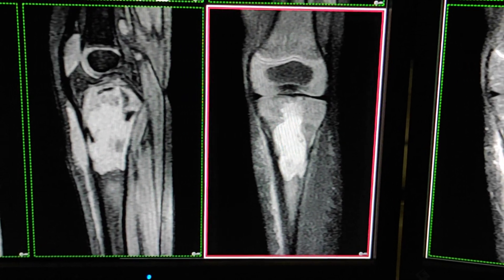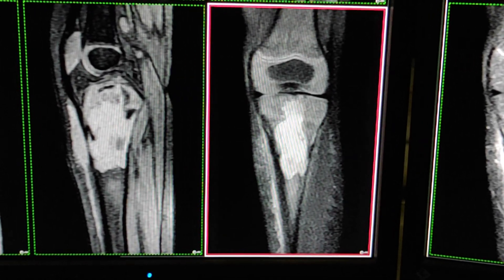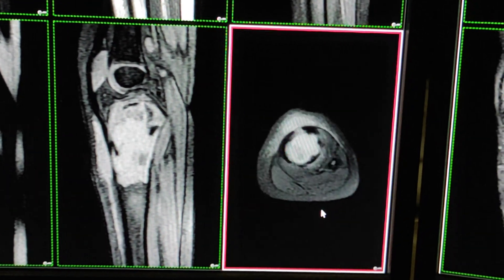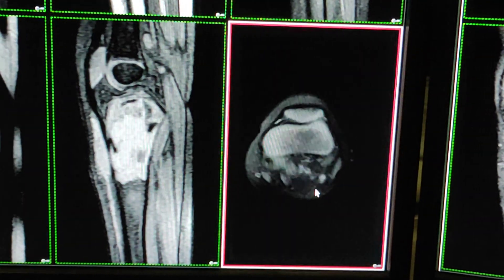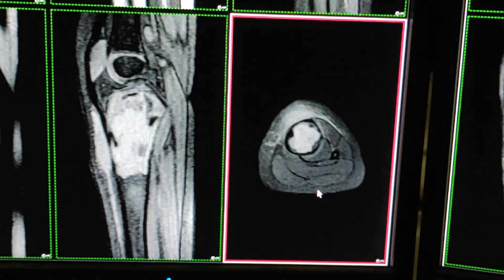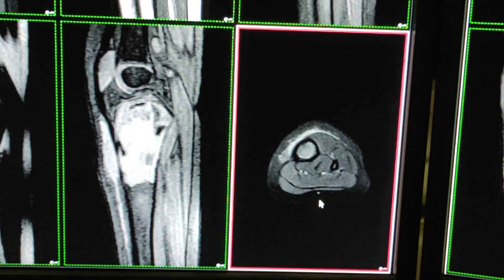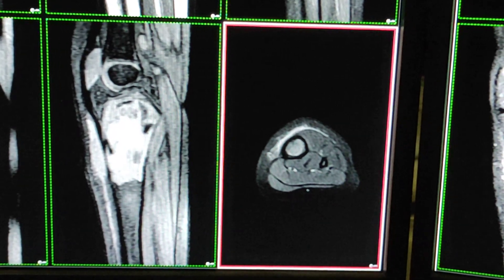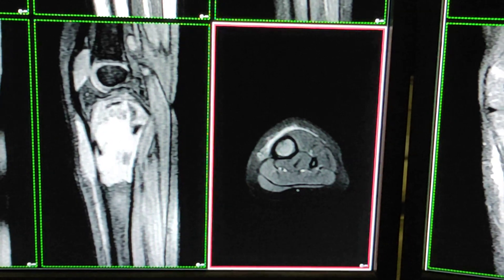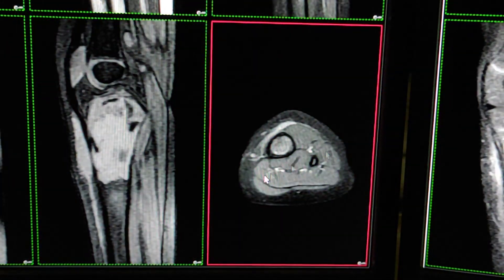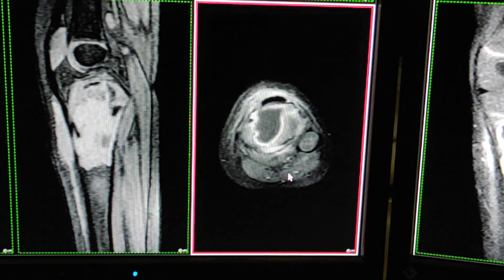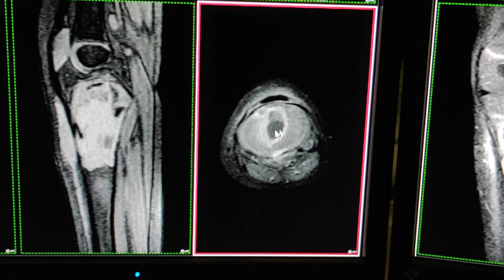Now I will show you the axial fat-sat PD — this is the axial sequence. Now we will see the contrast study. This is the axial post-contrast image. You can see the enhancement — this is an abscess.